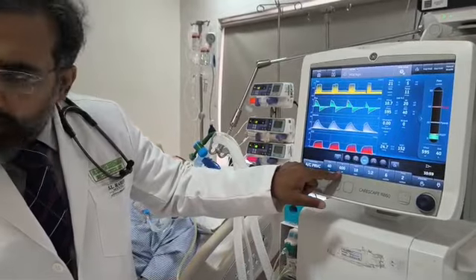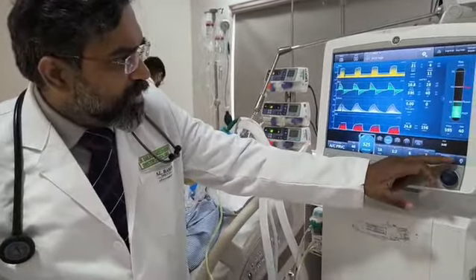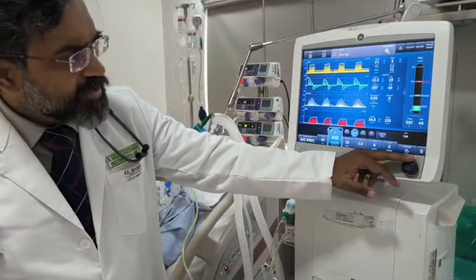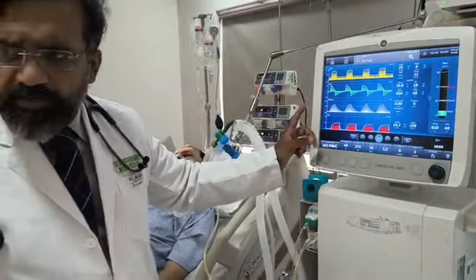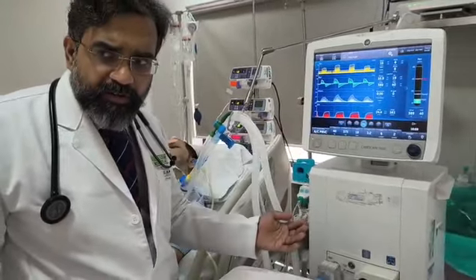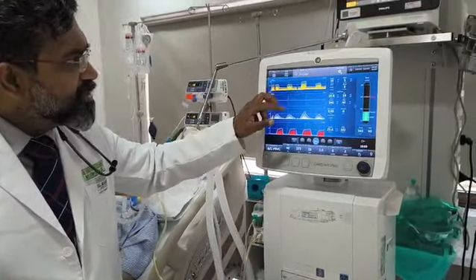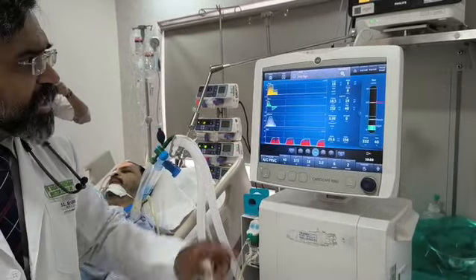But however, we cannot give 600 tidal volume. Since we cannot give 600 tidal volume, we have to go back to a smaller tidal volume, which we normally do for ARDS patients. And that waveform will come back again as a flow artifact. Importantly, flow artifact is not going to cause a problem because it's an artifact on the ventilator. Flow artifact has again started appearing now, and as time goes, we will see it better. Clear? It has started coming again.